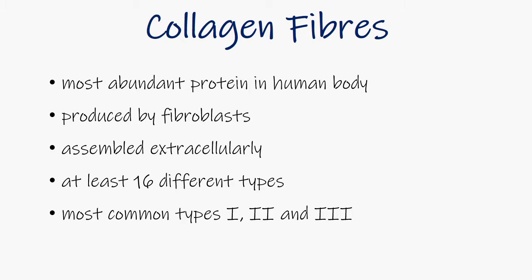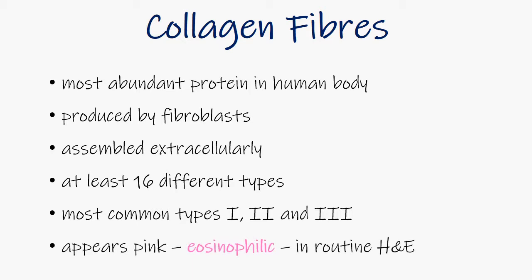As I am about to show you, most collagens appear pink or eosinophilic under routine hematoxylin and eosin staining. Let's take a look.